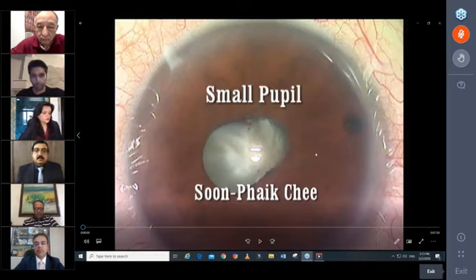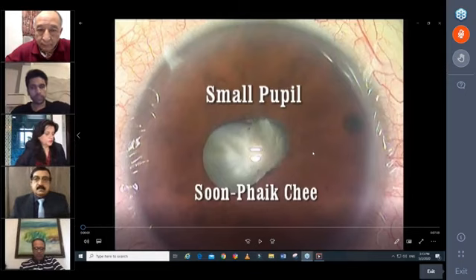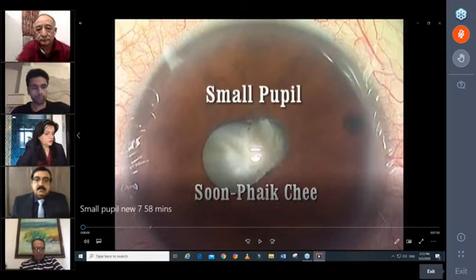Yes, I usually say there is a chance of that Argentinian flag. I would definitely use the Femto, because the Femto definitely decreases the chances a lot. And I say, no promises. I'll do my best. I'll try. And it's worked out very well.